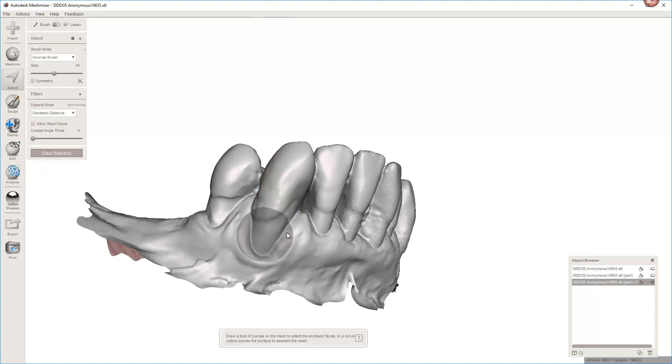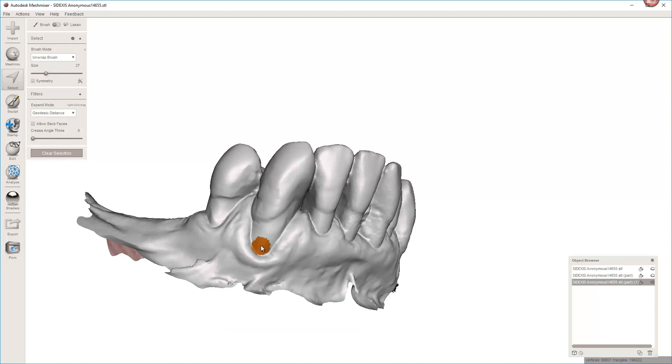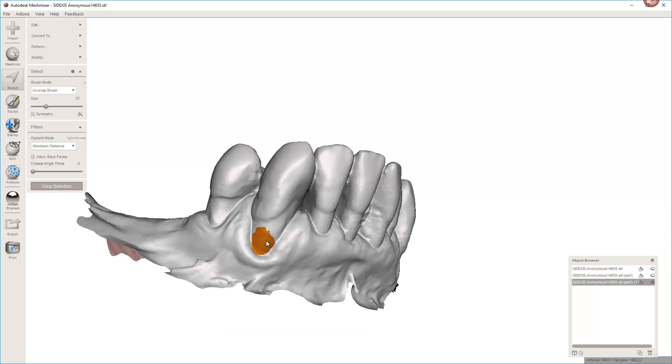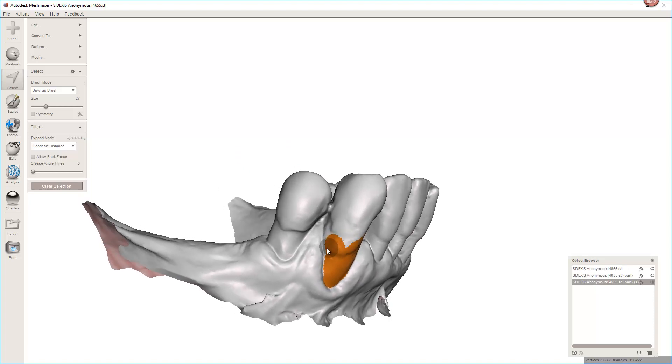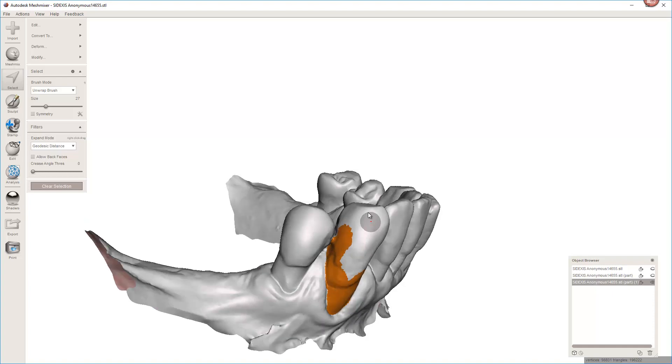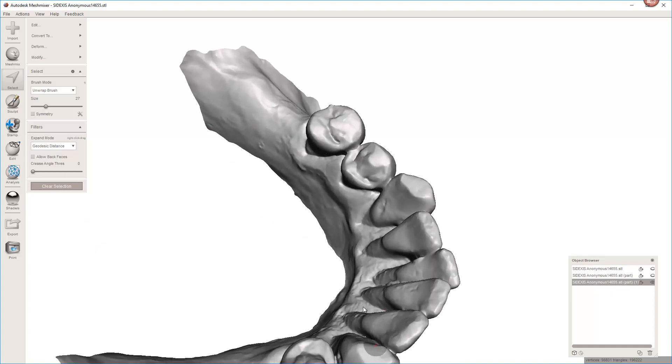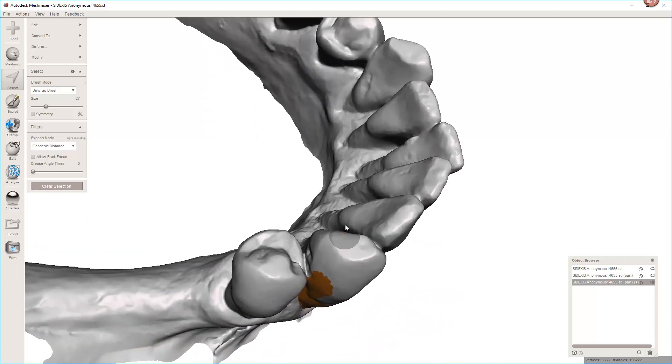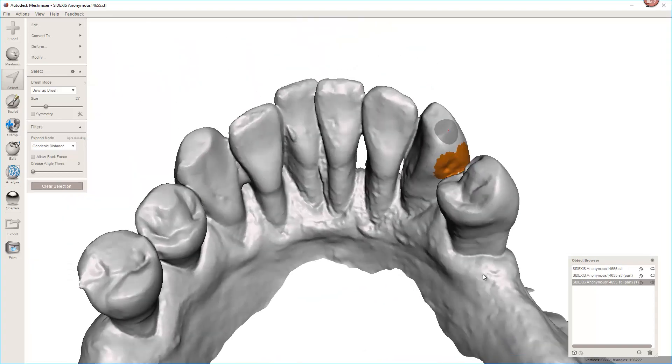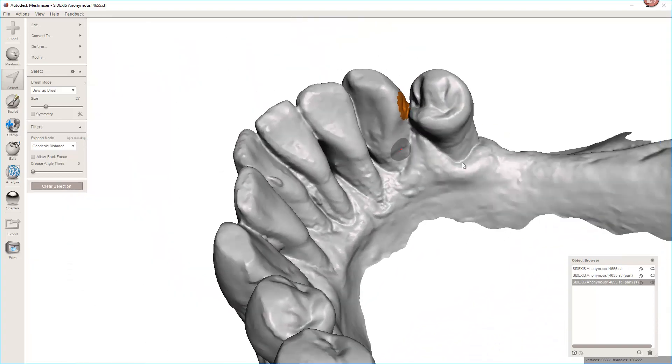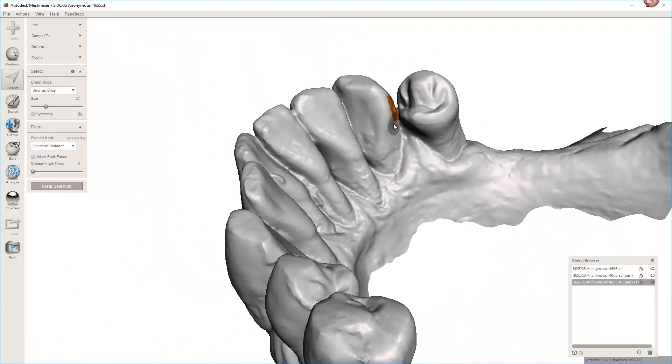So instead, I like to use my bracket buttons to make it a little smaller and make it about the size of the most apical aspects. Now, we don't have to be perfect here. One thing is I used to always select the entire tooth. I'm not worried about selecting the entire tooth and I'll show you what I mean by that in a minute.